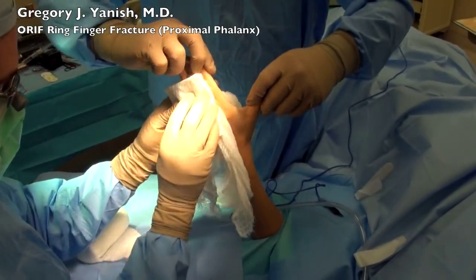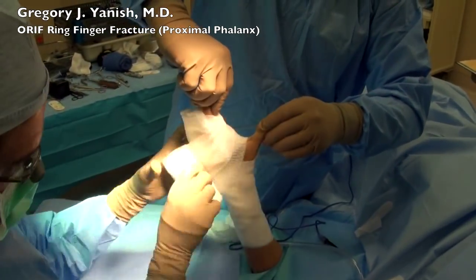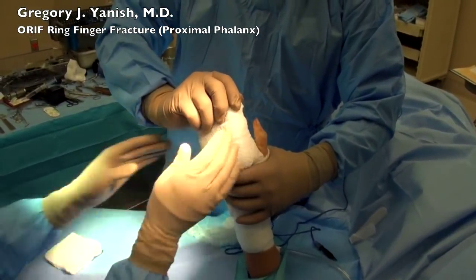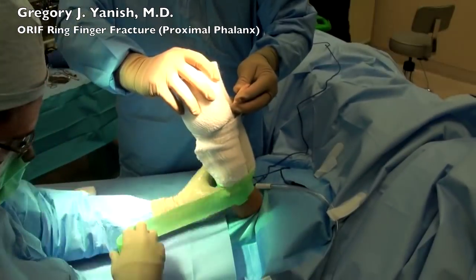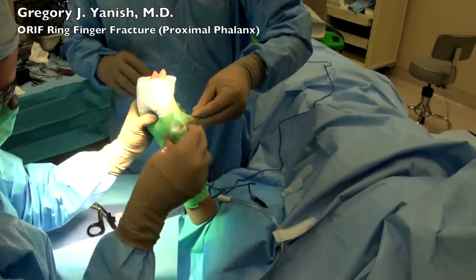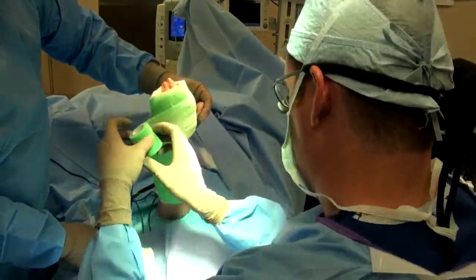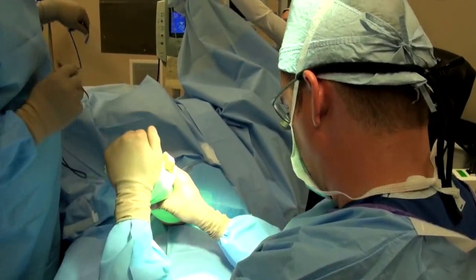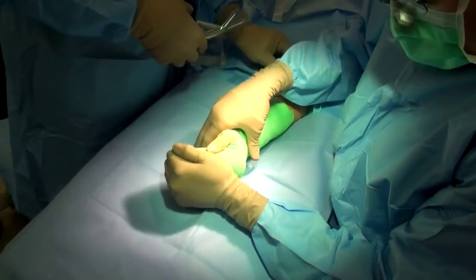We placed a xeriform dressing over the surgical incision and now we'll place a bulky splint. Some fluffs go between the patient's fingers followed by a bulky gauze and a curlax. After the curlax comes a fiberglass one-step splint which has been trimmed to fit, dipped in water to activate it, and we wrap with a soft co-band dressing. Although this looks like a cast, it's actually a soft material going around the one-sided fiberglass splint. Then we mold the splint into a safe position where the fingers are straight and bent at the knuckles at about 60 to 70 degrees, which allows for the best healing.